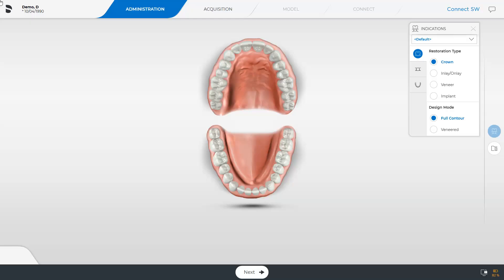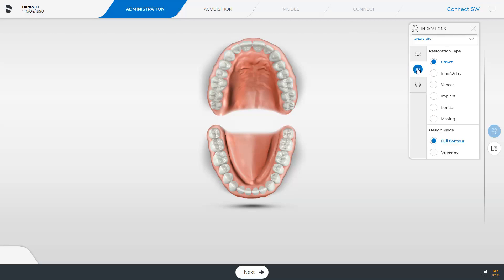We are currently in the administration phase and switch to the bridge indication for this workflow. First, we determine the position of the implants in the odontogram. Therefore, we enable the implant option and then tap the implant positions in the odontogram.